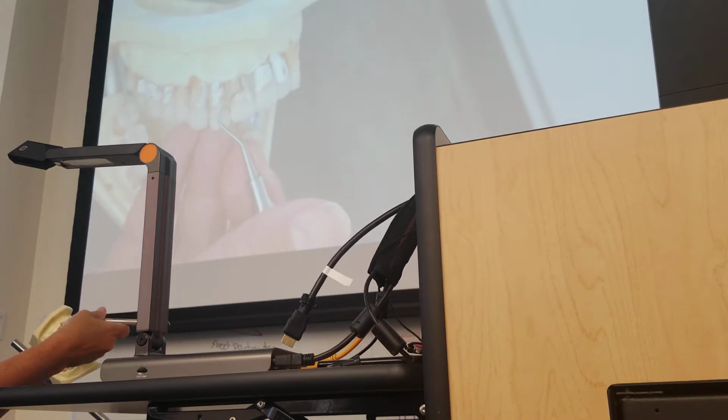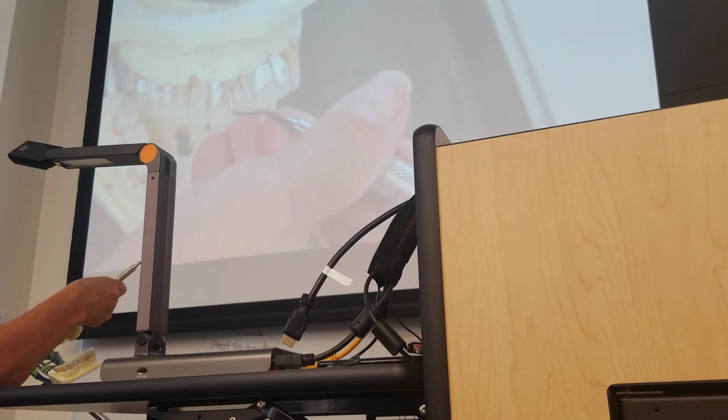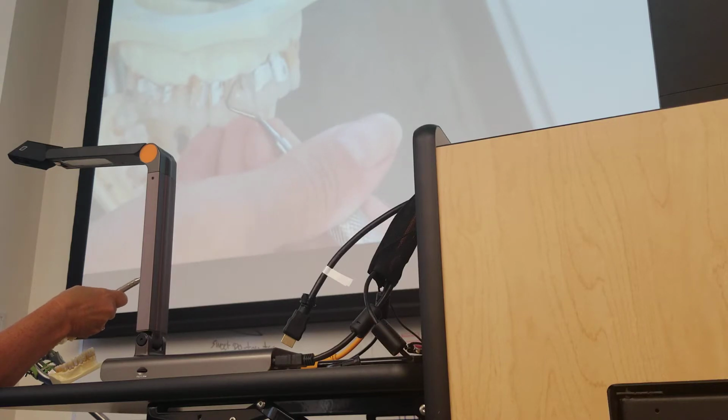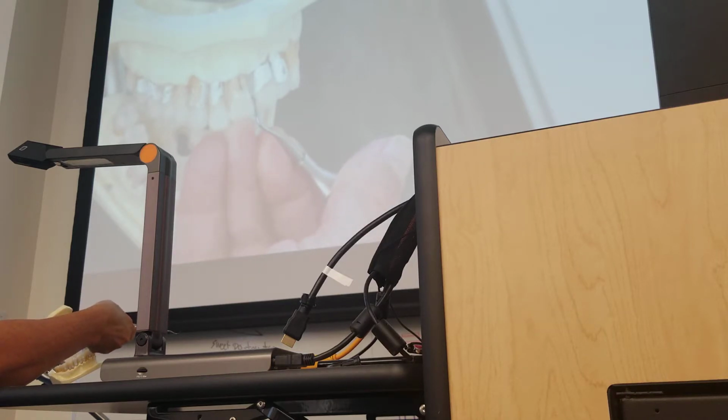So I'm going to insert as close to 0 as I can get it. I'm going to open it up to the correct angulation. I'm going to start on the other side of the midline. And there I am.